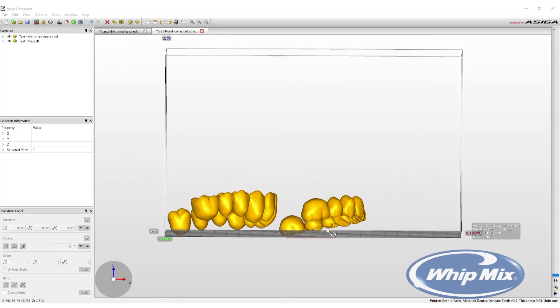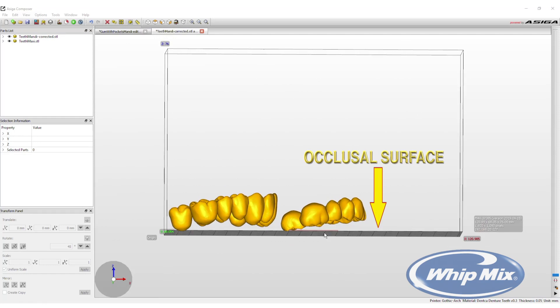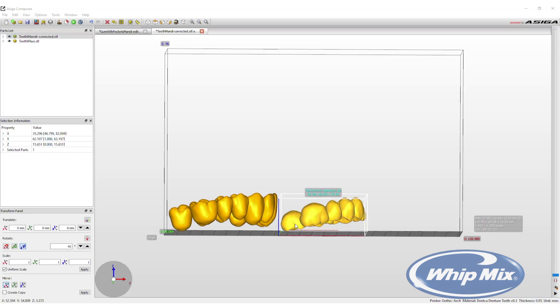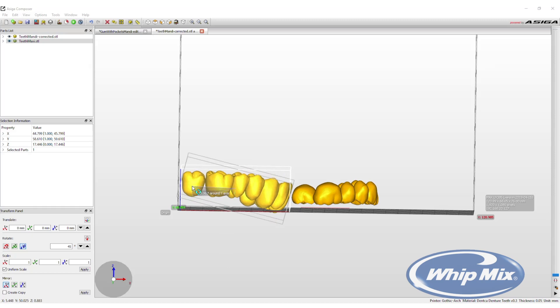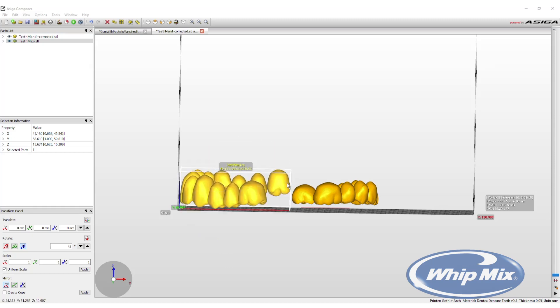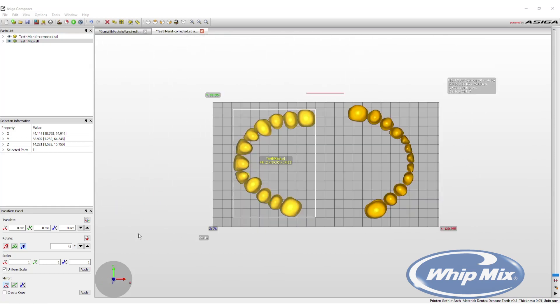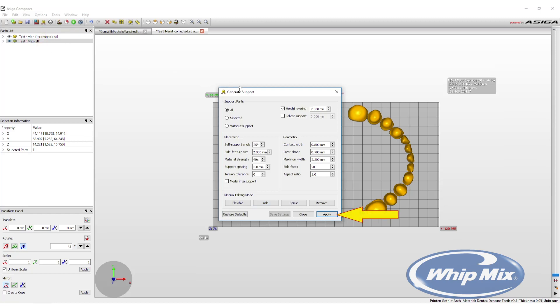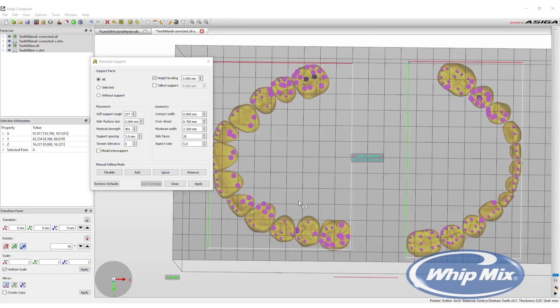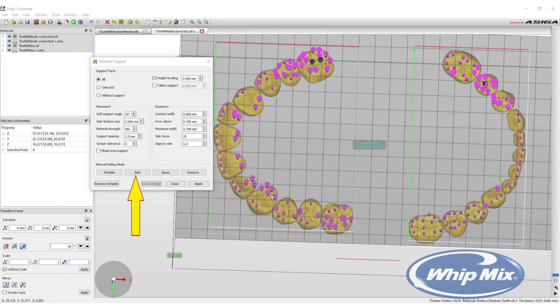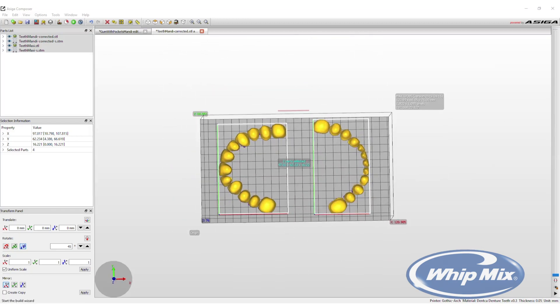For printing teeth, always have the occlusal surface pointing towards the build plate. This avoids having to cut supports off the occlusal surface of the printed teeth. Maneuver the teeth so they are aligned correctly. Left-click and hold to move the set around the build area. To select another set, left-click on it. Then right-click and hold to reverse the orientation so the occlusal surface faces the build plate. When finished with the arrangement, click Generate Supports and click Apply to generate the supports needed. To add supports, click Add and select where to place one. To delete, click Remove and select the supports to delete. When done, select Close.